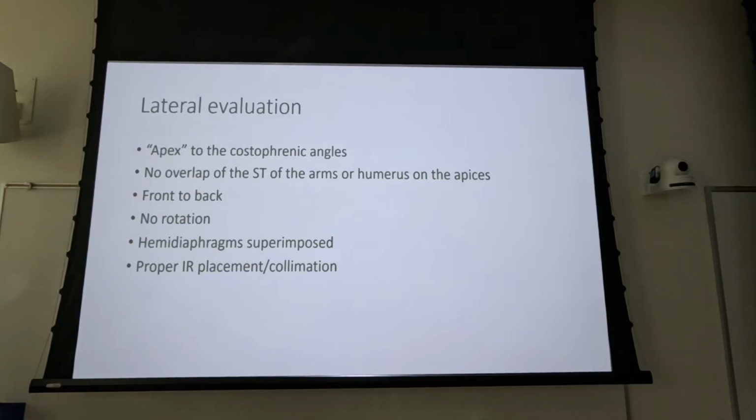So what if you use your image receptor, you got that patient as 14 by 17 image receptor, and you put it in lengthwise, and you have a patient take in a breath, and you get the costophrenic angles, maybe not, because sometimes your chest kind of comes back in, right? So your positioning is perfect, but the patient's projected off the image receptor, and you use 72 inches. What would you do?